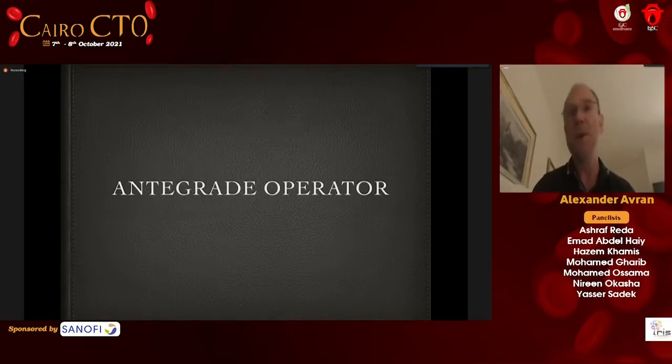Because you don't need the same devices if you are doing only antegrade, or antegrade retro, or antegrade dissection reentry. Most operators are mostly antegrade operators, so you need a little bit fewer devices than an operator who can actually do everything.